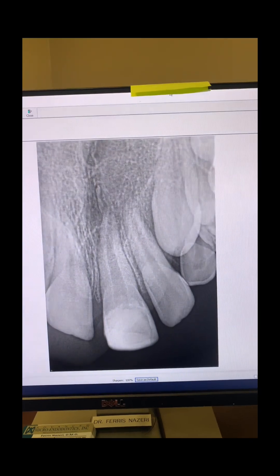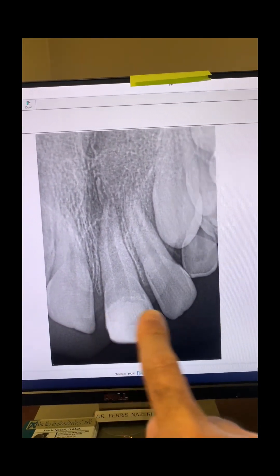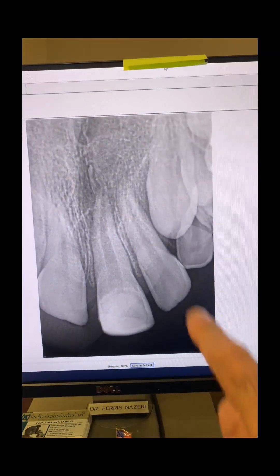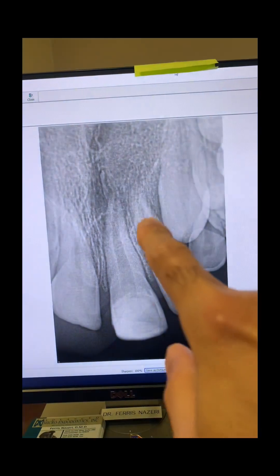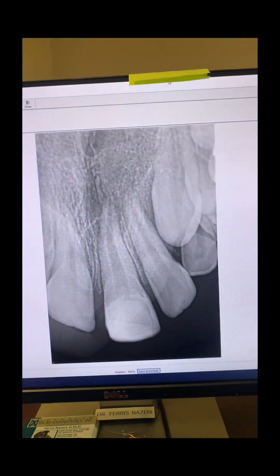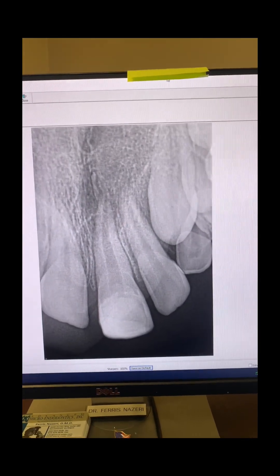As you can see, this tooth had been traumatized. Composite was used to rebuild the missing part of the tooth two years ago. You can see a wide open apex and a large periapical radiolucency. As I mentioned, there was labial swelling also associated with the tooth.